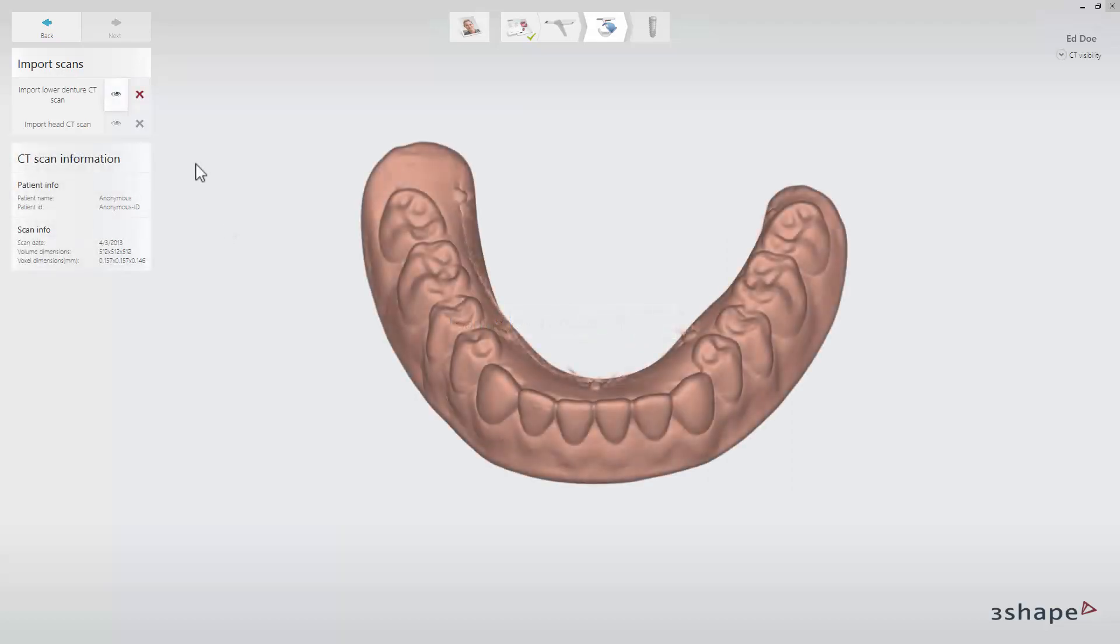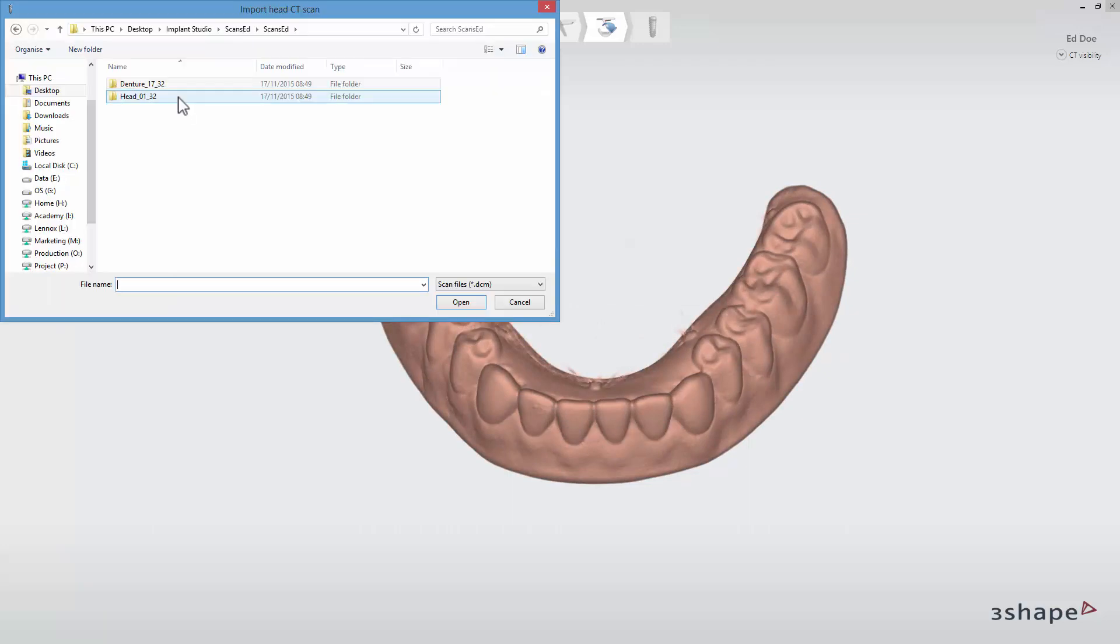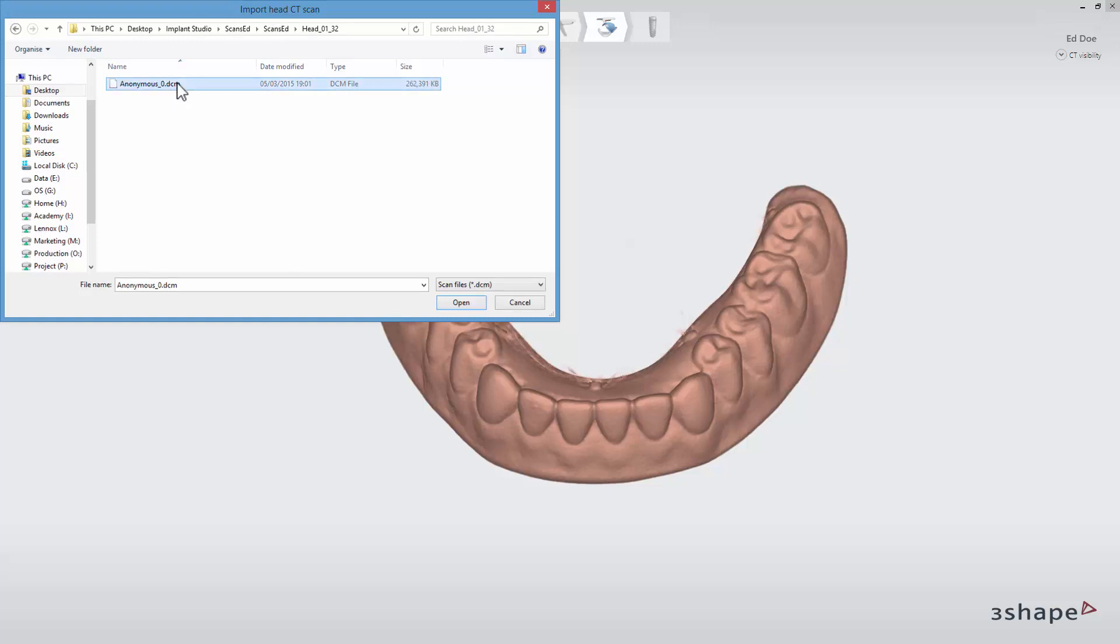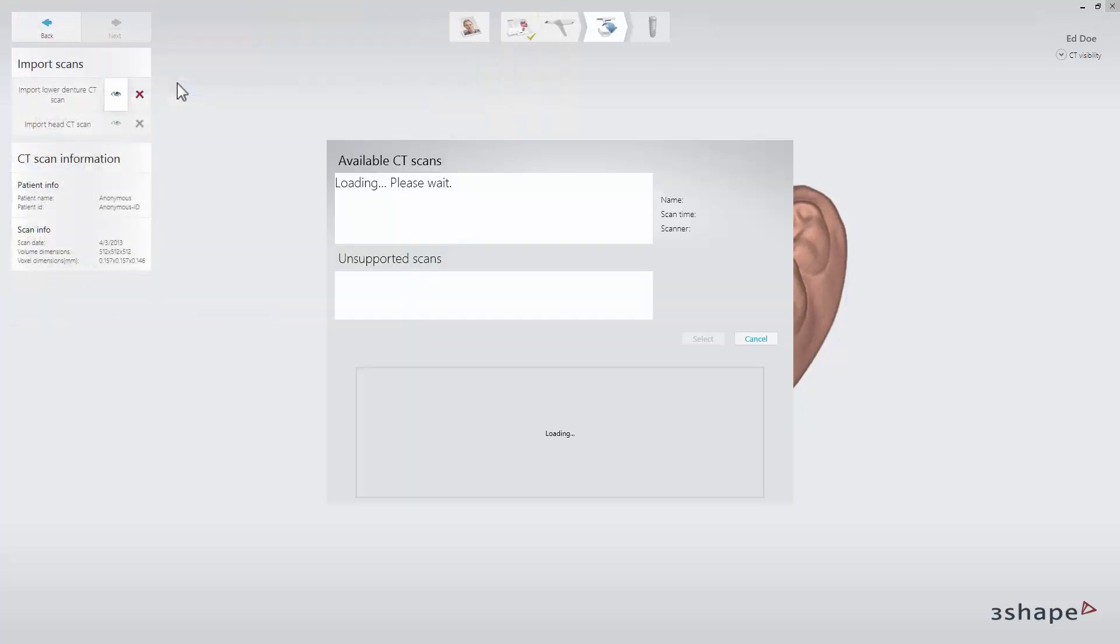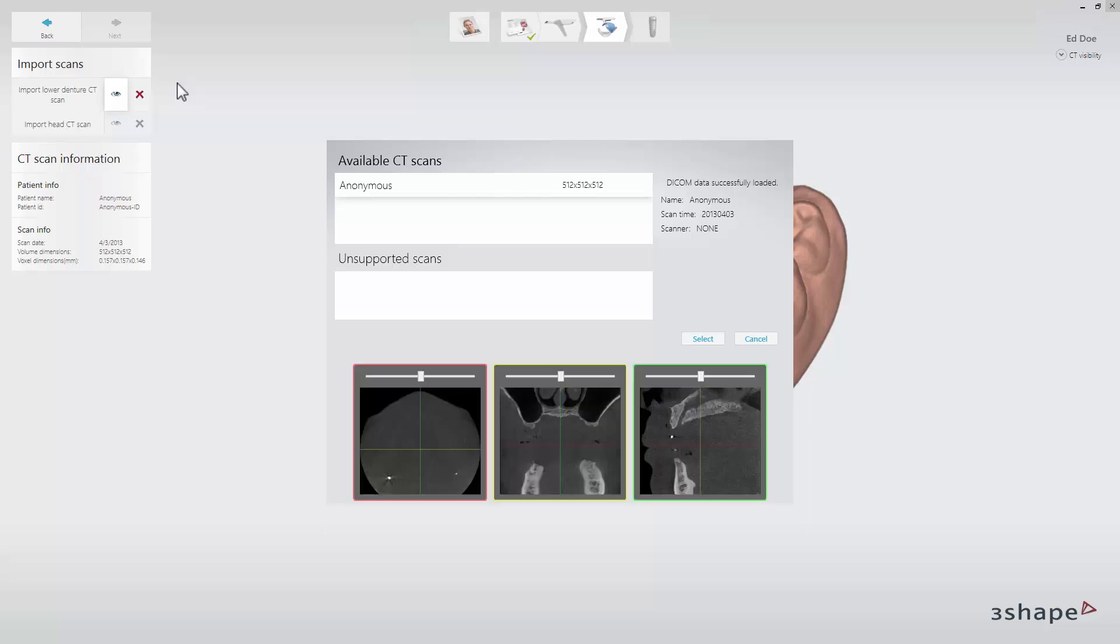To import the head CT scan, click the import head CT scan button. Browse to find the correct file. Preview the scan and click select to load the scan.